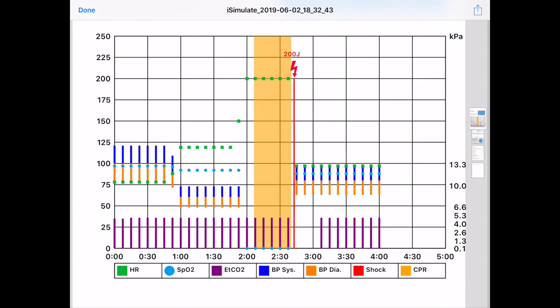The time is across the bottom and the parameter numeric is vertical. Heart rate is shown as a green square. Saturations is shown as a blue circle. End-tidal CO2 is shown as a vertical bar at the bottom of the screen. And the millimeters of mercury will be on the left and kilopascals on the right.